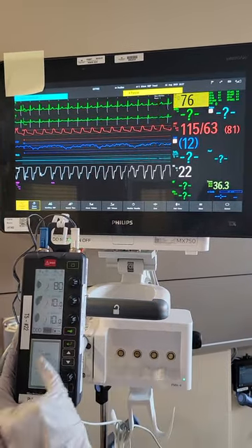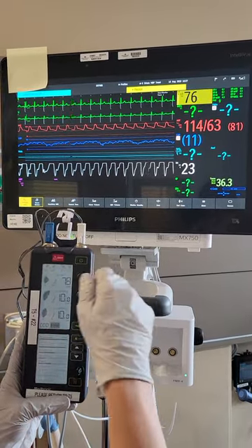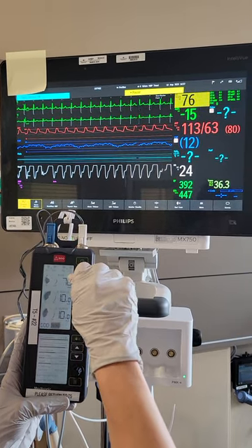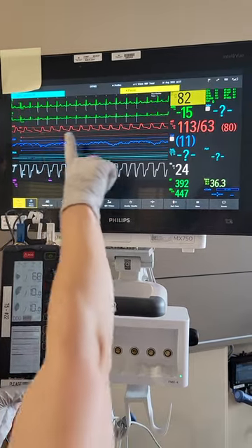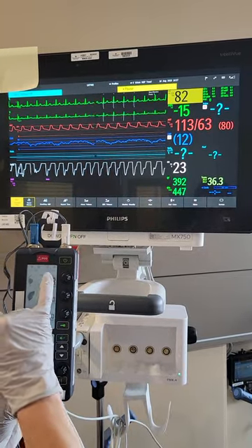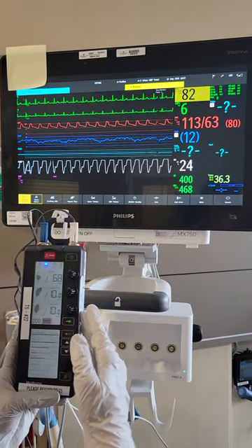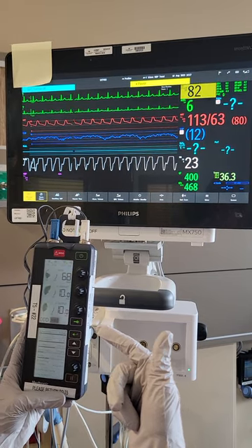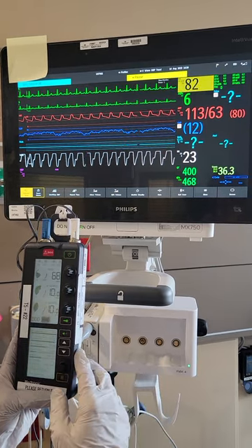It will always be locked, so just hit the lock key and then you'll be able to move the dials. I'm going to slowly turn down the rate and see if the patient's own rhythm kicks in. Now I no longer have spikes, and here it says sense and sense — it's sensing the patient's own intrinsic rhythm. This patient has an underlying rhythm. Now we can go on and check for output thresholds and sensitivity thresholds, which I will show you next.